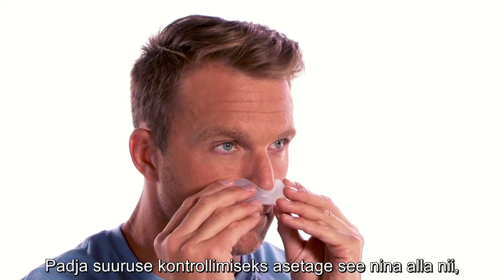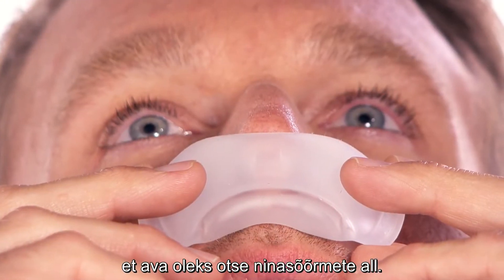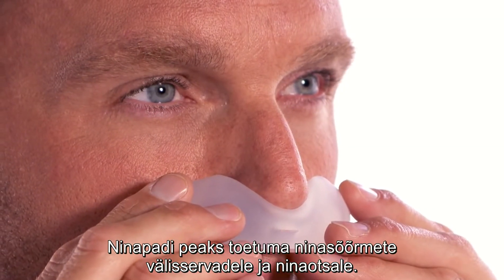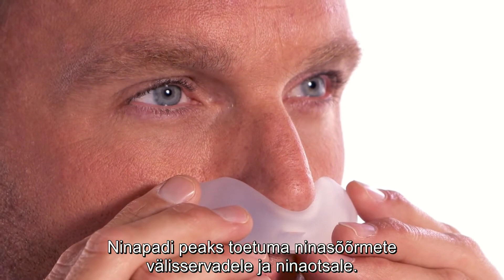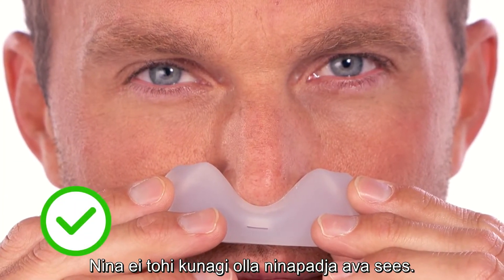To check the cushion size, position the cushion under your nose so that the openings are directly beneath your nostrils. The cushion should rest on the outer edge of your nostrils and the tip of your nose. Your nose should not be inside the cushion opening at any time.